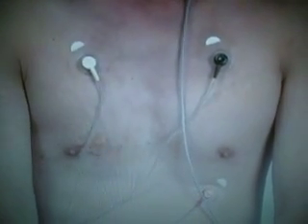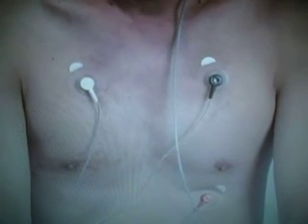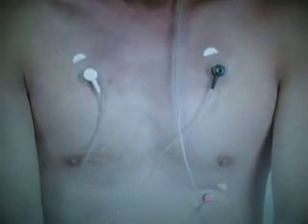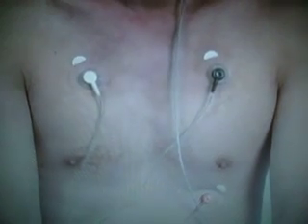This feature offers institutions equipped with the CardioSim an unmatched ability to capture the variety and depth of the patient world and bring it back into the classroom environment. Another component of the CardioSim system that allows medical teaching facilities to greatly extend the boundaries of the classroom is the Simulscope. With it, teaching at the patient bedside is made easy, more effective, and requires less time.